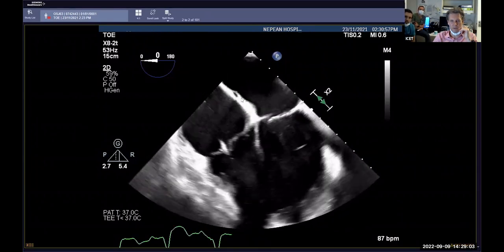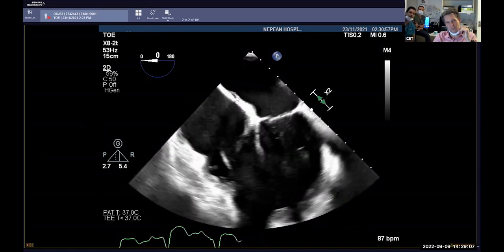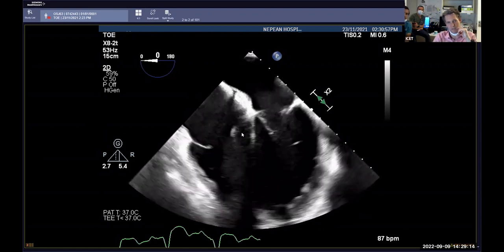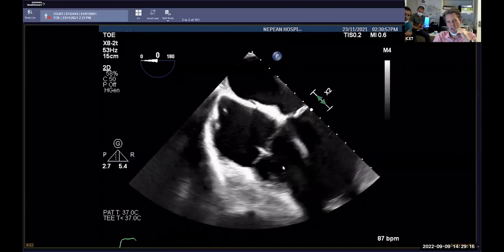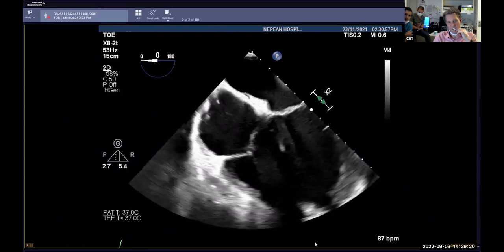Just in standalone, I think we can see here maybe a bit of a lipomatous interatrial septum, where you've got a clear demarcation in there. We should go hunting, obviously, looking for any kinds of PFOs. In terms of that left ventricle, there's clearly a little bit of dropout in the interventricular septum in the midline.